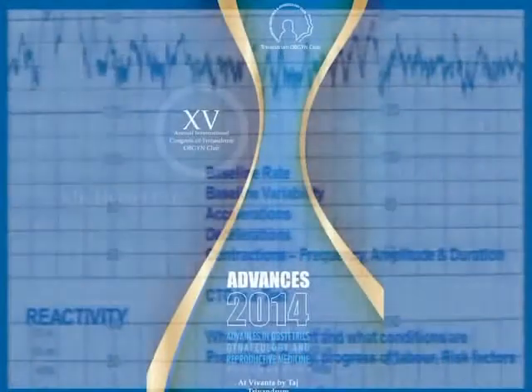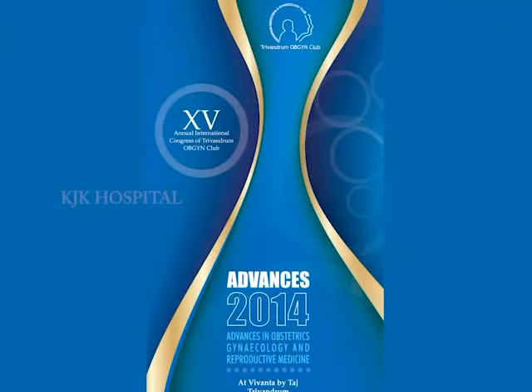Now, we must always remember CTG is a test, like doing a full blood count. So you have to really take into the context of the clinical scenario, about the parity, the progress of labor, and the risk factors. Because if it's a pathological CTG at 9 centimeter in a multiparous woman, you may not do anything. If she is 3 centimeter in a primigravid, you might want to do something.